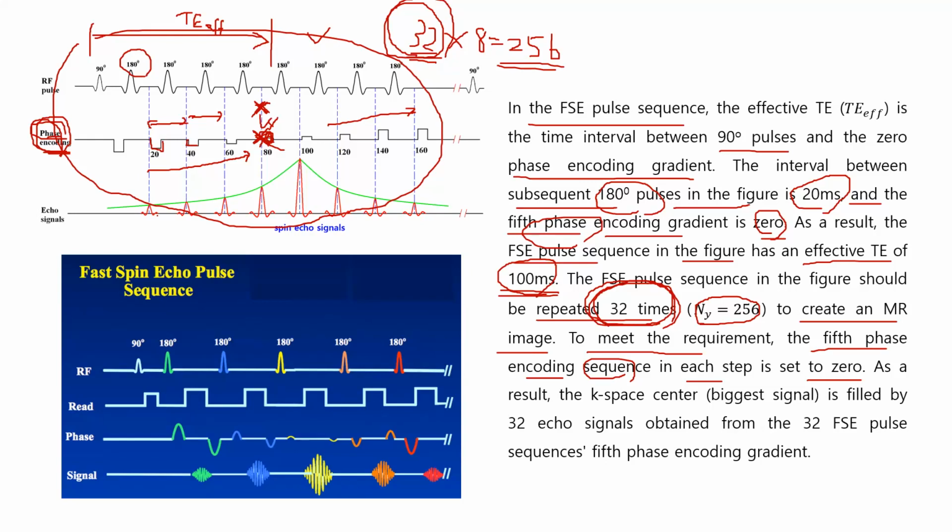The position of the zero phase encoding should be fixed here.